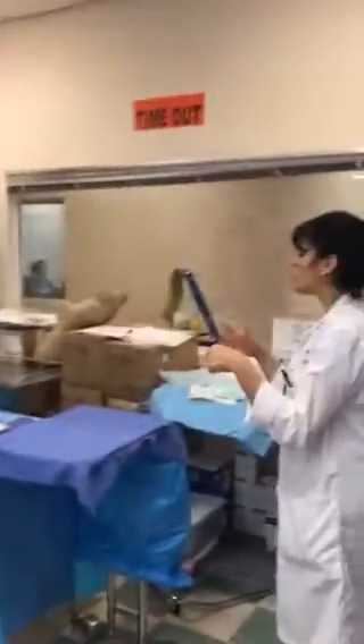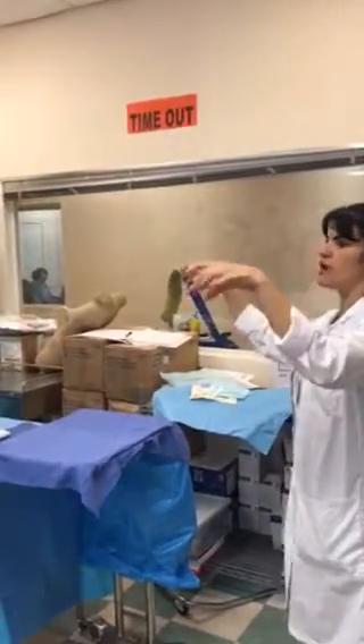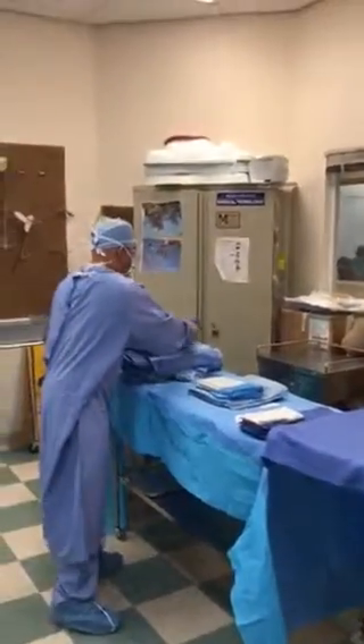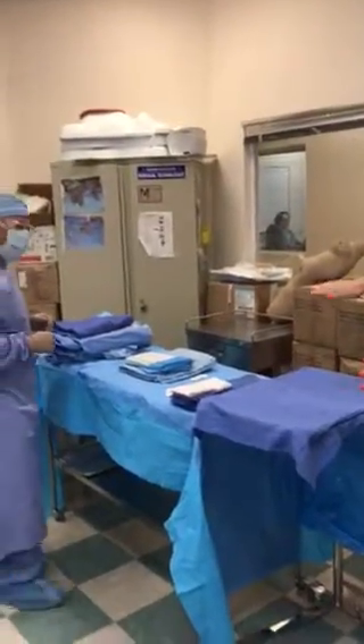You can fold it however you want, just so that when you open it, it's back to how you had it. Put it on top there. Now you're going to set this aside — we're not going to use that, it's for laparoscopy.